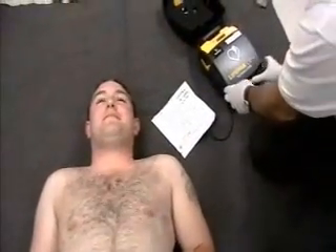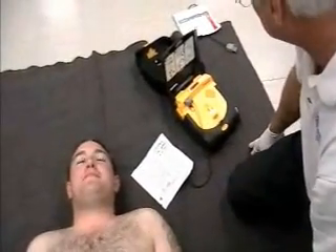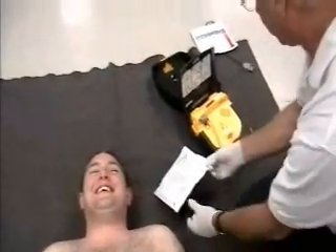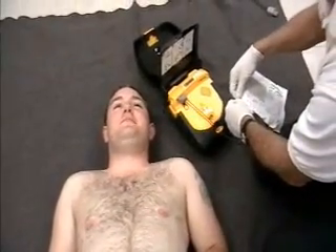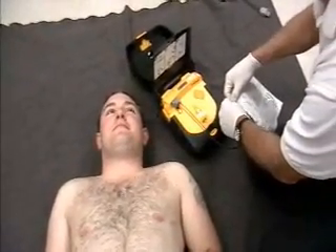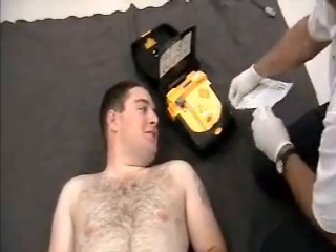So we have a live AED and I'm going to go through the process of putting it on just the way that we would do it in a real setting. Opening it up — the device says: 'Call for help now.' Give me all the instructions. 'Remove all clothing from patient's chest.' We are ready to go. 'Pull red handle to open bag.' Okay, I'm opening up the AED package.